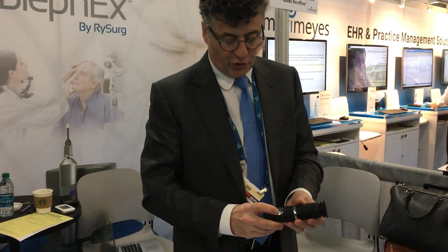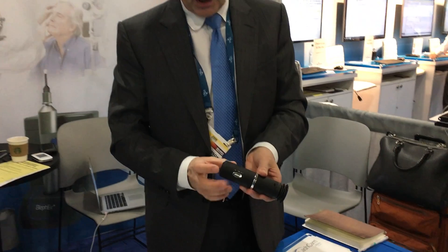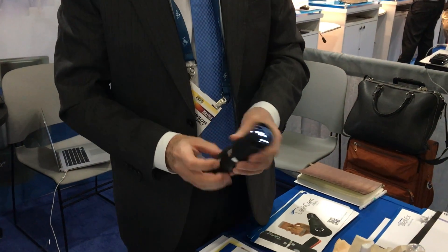The first thing you want to do is just turn it on and make sure it's fully charged. It's got to be fully charged.